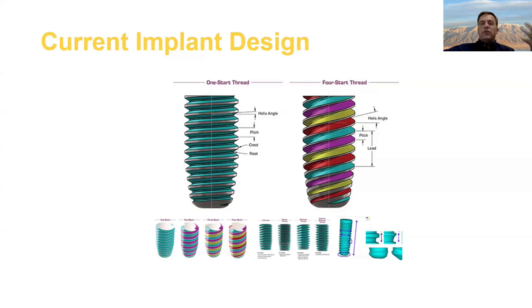So that's just another thing to think about when you're purchasing an implant. This will probably last the rest of the patient's life. And while we don't have a crystal ball, some companies seem more stable and more likely to be around making parts than others. And I think that should come into play.